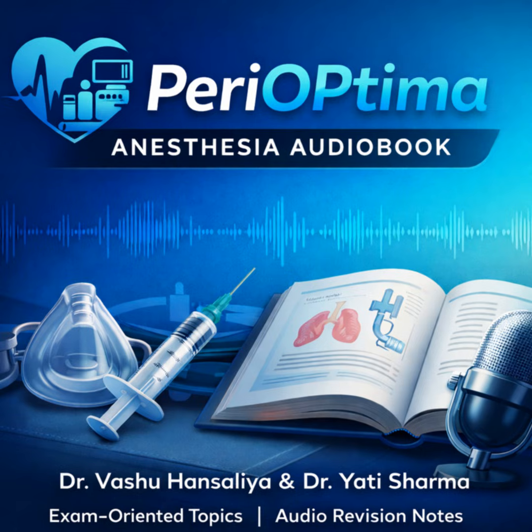This is such high-yield material, we need to make sure everyone can describe the components and the mechanics perfectly. Okay, let's assume our listeners know the basic parts. We should focus on the clinical relevance of each component. What makes it important in practice? Good idea. Let's start with the handle. It's more than just something to hold on to. Much more. The handle is your point of leverage.